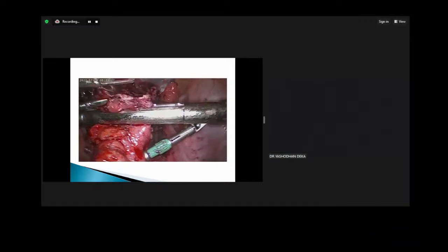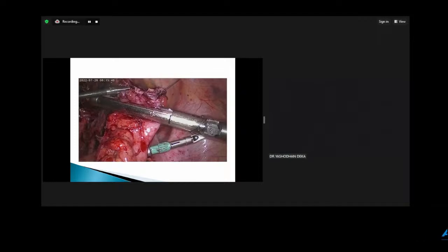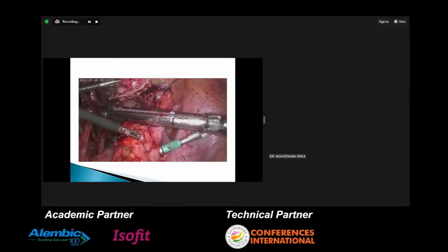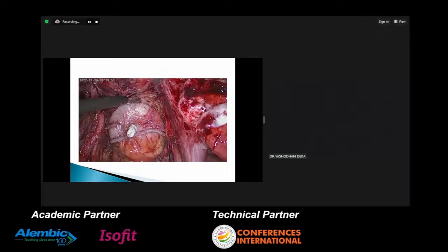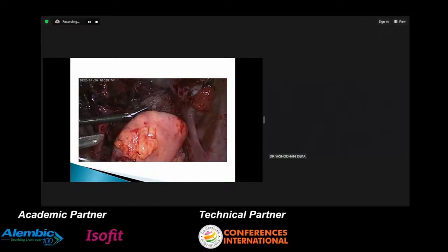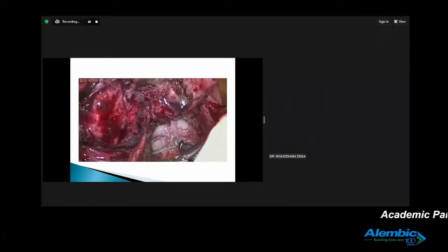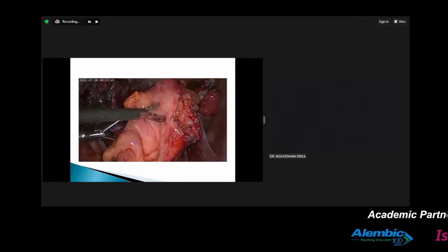So yesterday we did two bowel resections, where in one case we had to do an end to side, and in one case the resected segment was almost about 5 to 6 centimeters. So we had to go for an end to end because the mobilization was not adequate. So once the proximal segment has been ligated, the circular stapler gets introduced from below, and then you just make sure that the anvil is fitted on without any rotation of the bowel. So make sure that the bowel is rotated in a correct manner and the anterior surfaces are matching to each other. And this patient is doing extremely well, and she's up for ART in the next month.